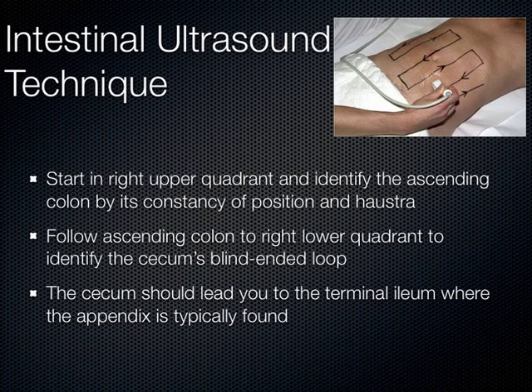Whereas in the small bowel, we have something called plicae circularis that do cross the entire wall of the bowel, which I'll show you in a minute. That's kind of how we quickly can decide between small bowel and large bowel on any imaging study, looking at haustra versus plicae circularis. That sounds like it's minutia, but actually that comes into play quite a bit in most fields, so something you might want to remember.